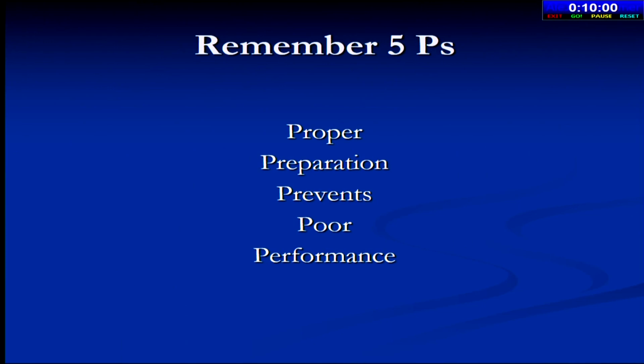So make sure what you are going to do. Don't decide on the spot. I can decide on the spot, and I sometimes regret. I should decide beforehand, for this patient, what I have to do, which kind of flap, where, which site, and all that. So be prepared, and always be sure that you have put the betadine in the conjunctival sac at least 10 minutes before, or 5 minutes we say, but in fact we sometimes put it 20 minutes before. My residents do that, but generally 10 minutes is good enough, and not the 10%, does somebody advocate that?